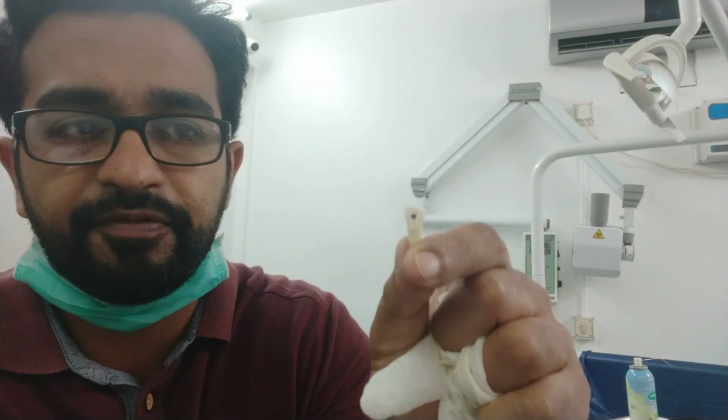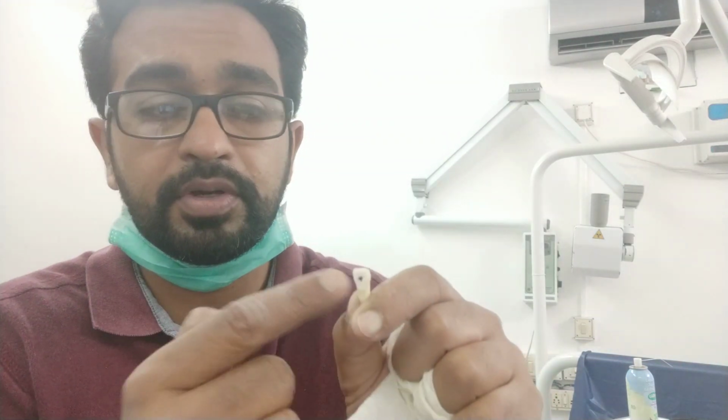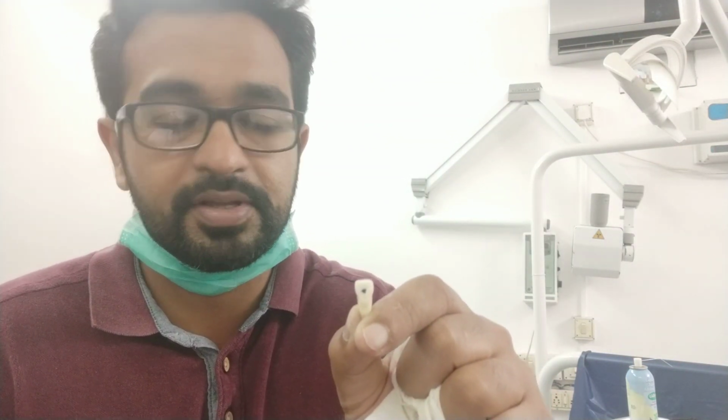So now this is the tooth, and you see I have done a marking on the palatal surface of the tooth. This is actually the point where you are going to do the access opening with the round burr number 2. Right, so I have put my round burr in the autoclave. Everything, all the burrs, only one burr was outside, so I am using the straight fissure burr. But you don't try it with the straight fissure burr in the very beginning. What will happen if you do it with the straight fissure burr? It may get perforated from the facial surface. So take a small round burr and do the access opening. I am going to show you how to do the access opening.